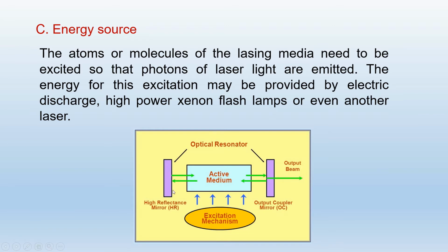One mirror is fully reflective، ساعد بالfeedback and amplification of the light. The other one is partially reflective that permits the transmission of the laser light.